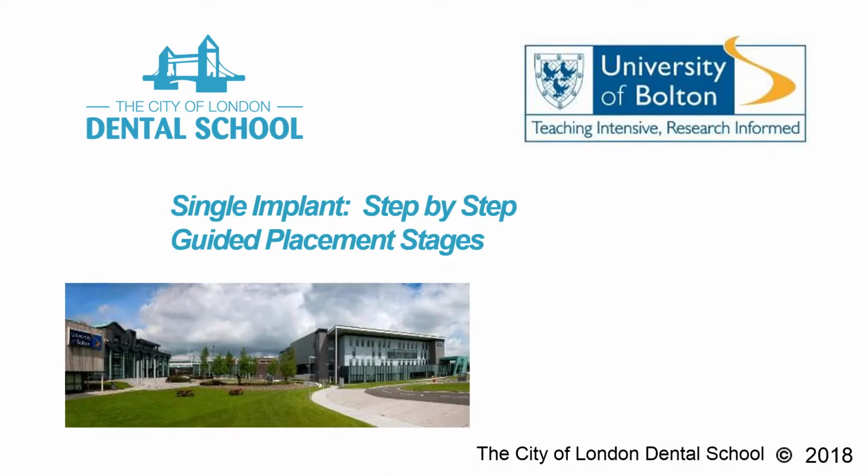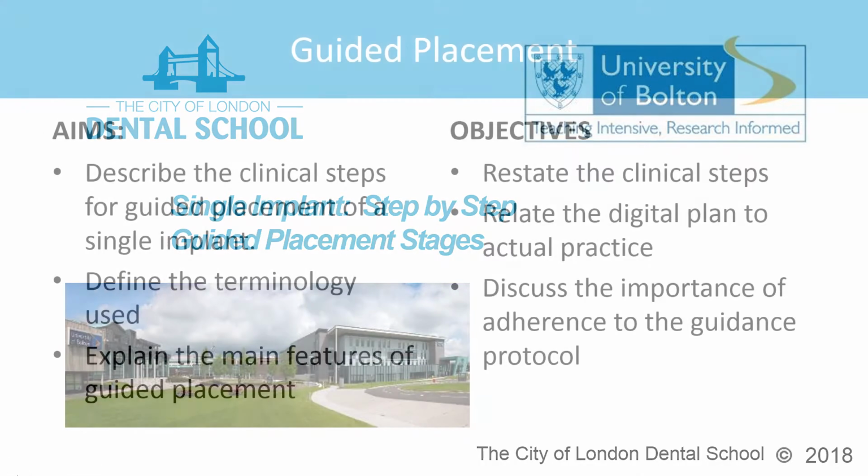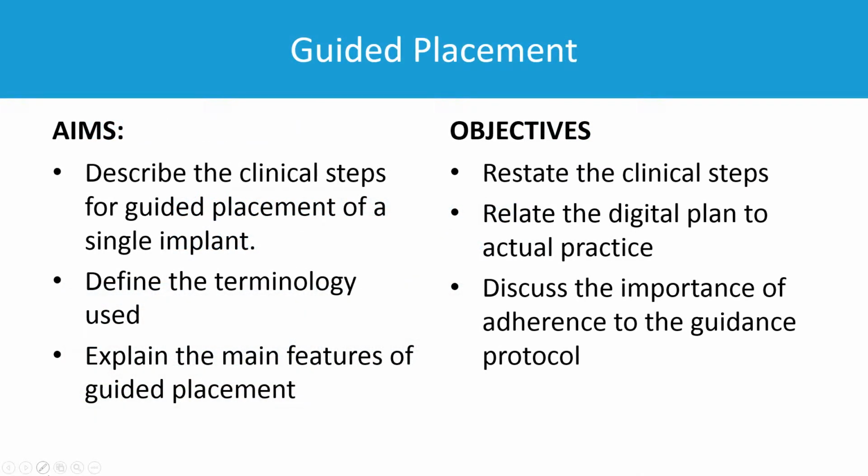Now, in the previous lecture, you'll recall how we placed the implant and positioned it very carefully using software to digitally manipulate images and place our implant in the optimal position. Now we have to take this digital information from the virtual environment into the real environment, and we do this by use of a guide. Now, guides are very specific devices which are accurately made to help guide you with your surgery.